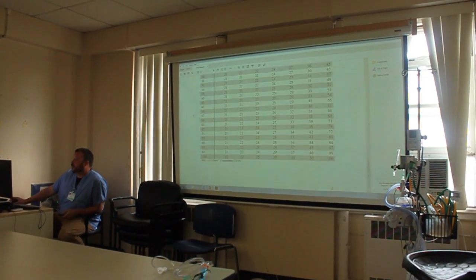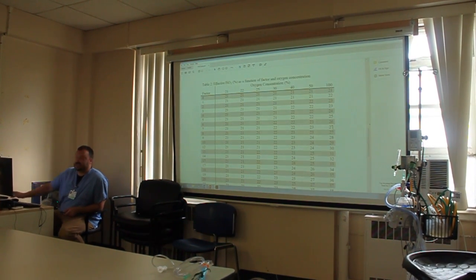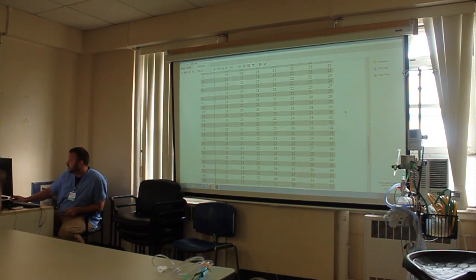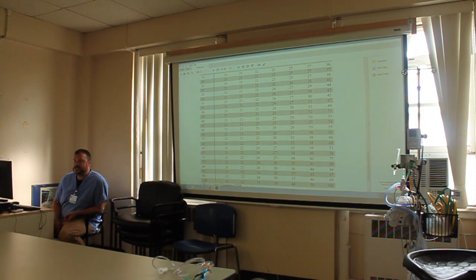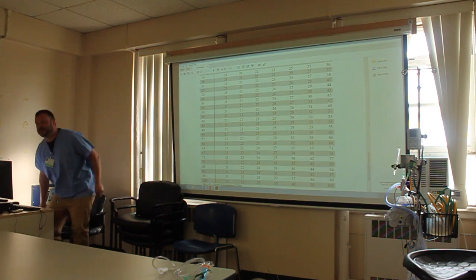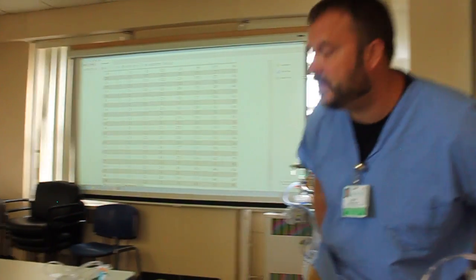Yeah. So we would go to that factor of 67, and then we'd go all the way across, to where our 100% is, up there. Follow it down. So we could assume that that patient was actually getting about 74% FiO2. Pretty confusing, right? So option C, not confusing? Okay, good, we'll go with that. Option C is just assume they're getting a whole bunch of oxygen, straight up. Cool? Does that sound good? So it's not one of those things where you're like, oh, 2 liters, that's like 28% oxygen, who cares, we should be good. That might not actually be the case.